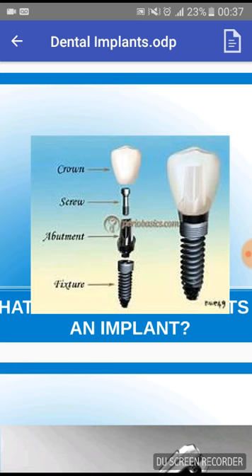Okay, sorry. What types of materials are used? So you have metals. It's the same materials that are used for crowns on the whole. So you have your noble metals, which would be gold, palladium, platinum. You also have stainless steel, tungsten, titanium. I see a lot of titanium prostheses used. There's also ceramics, alumina, hydroxyapatite. There's polymers such as polymethyl methacrylate or PMMA, or PTFE, polytetrafluoroethylene, as I mentioned before, which is used in grafts, like for instance the femoropopliteal grafts, those kinds of things.